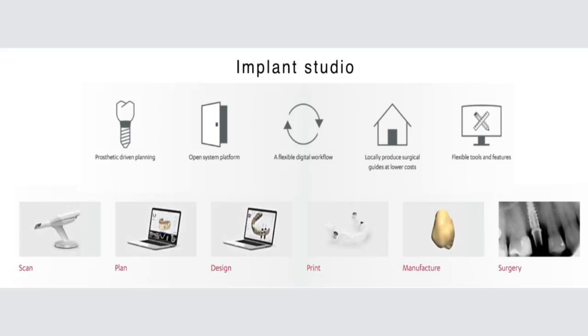It depends on the math that you do, based on your business model and the hour and the practice, and so on and so on. And also what gives you pleasure, right? For me, for instance, to design a crown, or single implants, I do it with pleasure. And I try to balance the pleasure with the profit, of course, otherwise no one can pay the bills. So Implant Studio has some advantages and some very important components. One is that you drive your prosthetic component for the implant treatment. So you drive the prosthetic planning, which is very important.